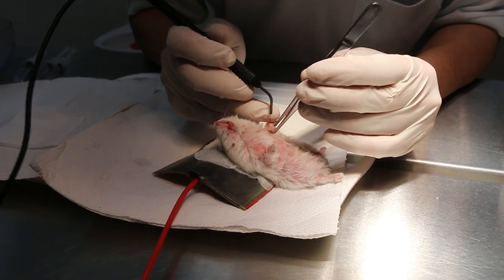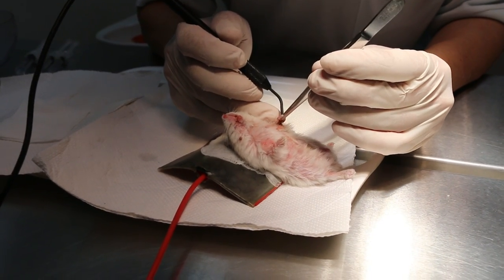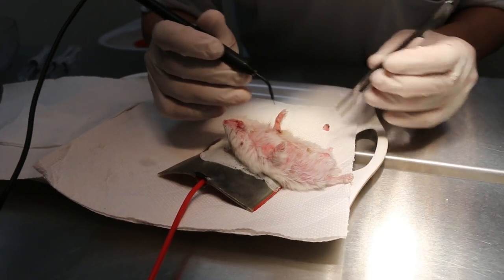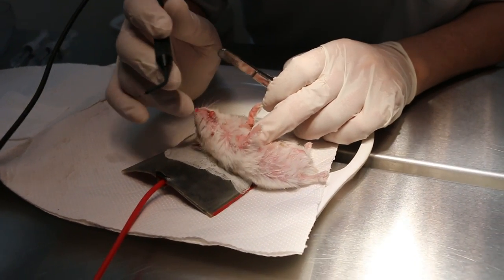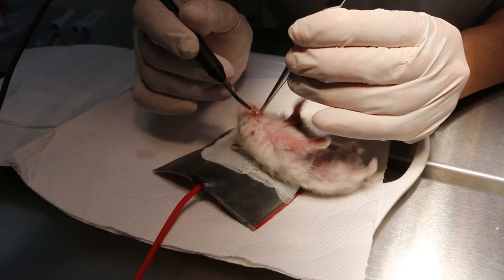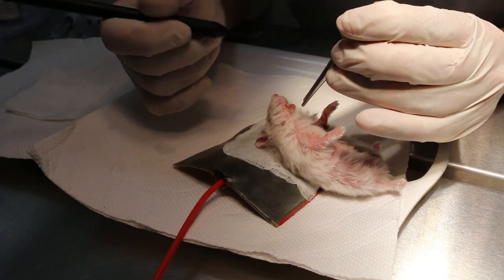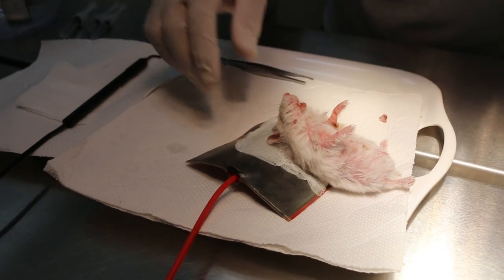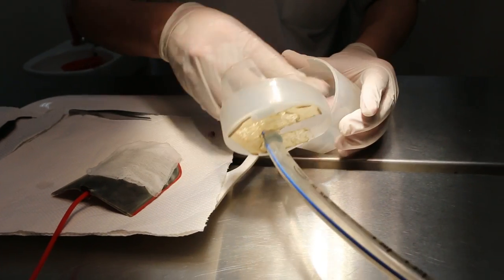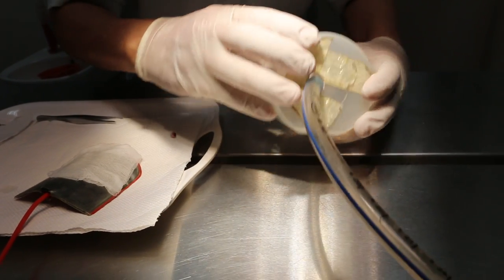The hand is in the way, so just put it in the hand. Now the wound will heal by itself. Now, you see if there's any other wart. There's one here. The hamster is waking up, so I'm going to give some gas again. A bit of gas, a few seconds.